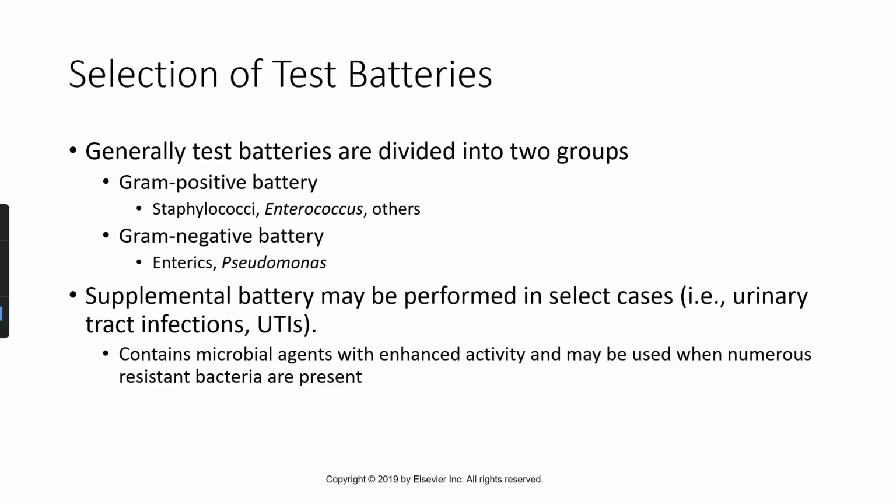A supplemental battery may be performed in selected cases. So for urinary tract infections, there may be a urinary battery. It's just a series of drugs that are typically used to treat urinary tract infections.